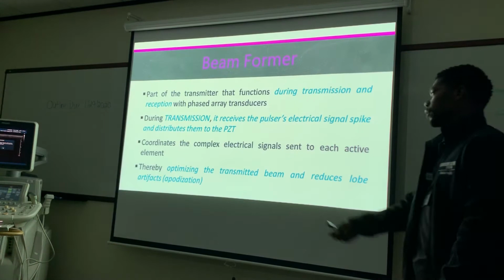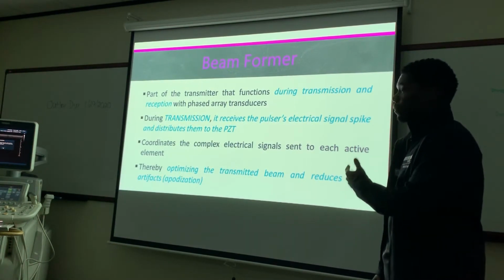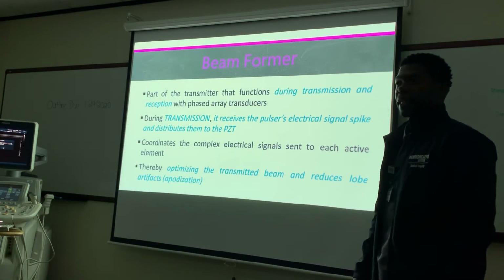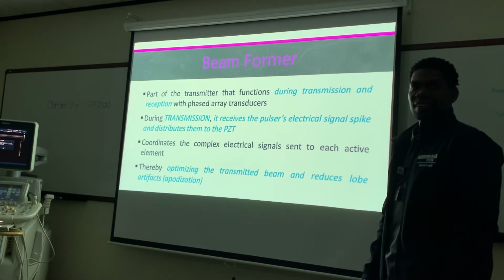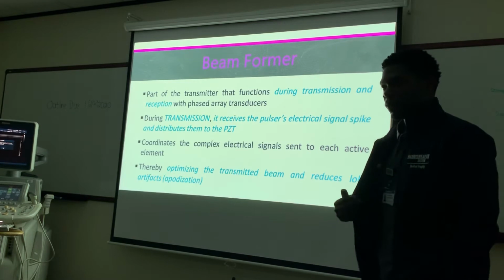All right. So, can anybody tell me about apodization? Because that's also what the beamformer does. What is that? Anybody? That's going to be on a rate sheet 100%. What's that, Myra? It reduces the side lobes, right? How does it effectively do that, though? How is that happening?